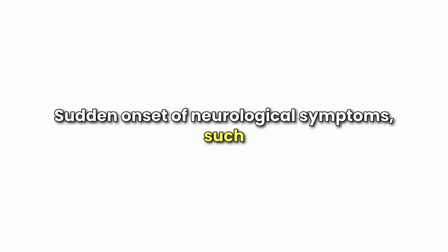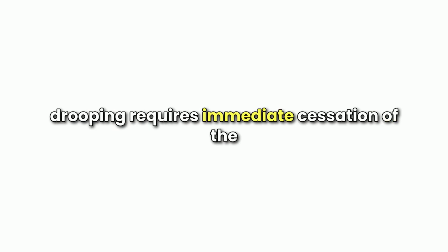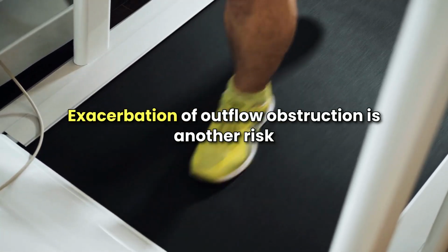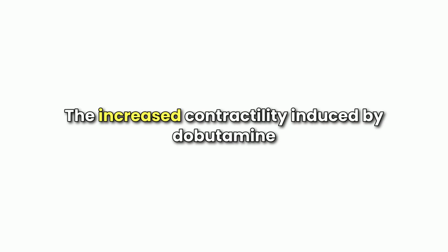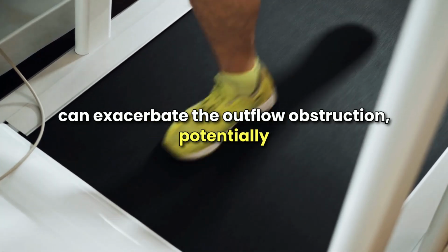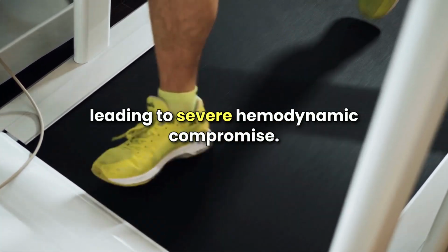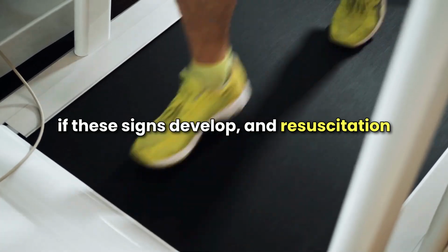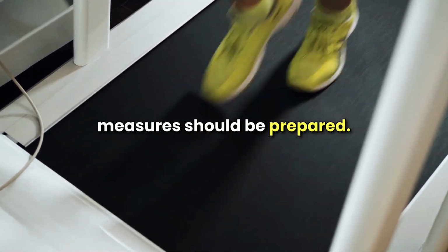Sudden onset of neurological symptoms such as weakness, speech difficulties, or facial drooping requires immediate cessation of the test and emergency medical intervention. Exacerbation of outflow obstruction is another risk in patients with severe aortic stenosis. The increased contractility induced by dobutamine can exacerbate the outflow obstruction, potentially leading to severe hemodynamic compromise. This may result in severe hypotension, syncope, or sudden cardiac arrest. The test should be terminated immediately if these signs develop, and resuscitation measures should be prepared.